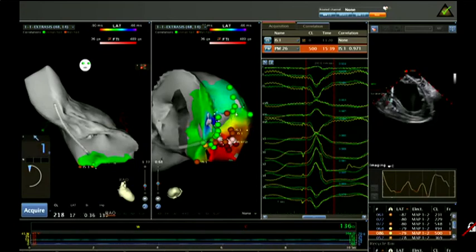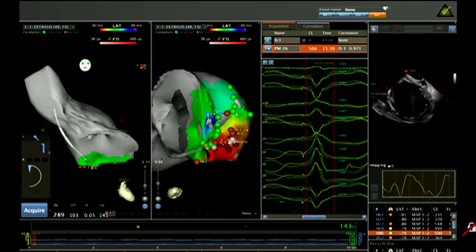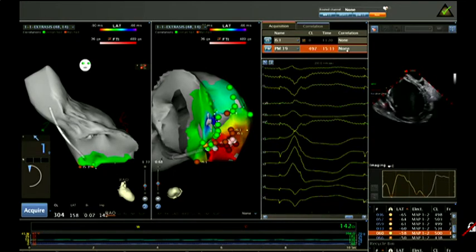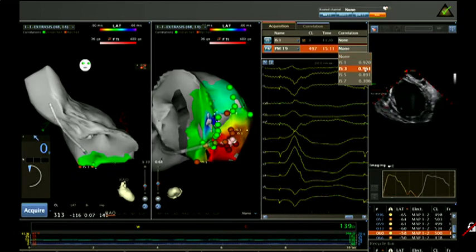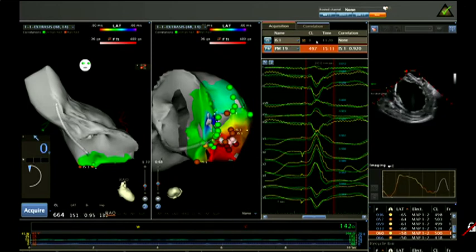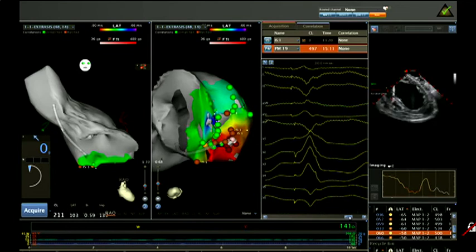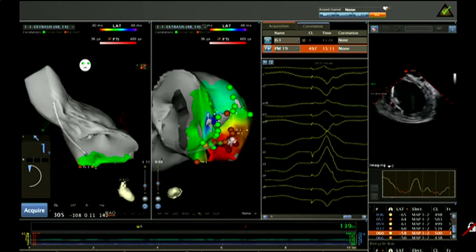And this is what happened. If you see the morphology, you can show a different point. You can see here the morphology. Give me just the green one. It is very easy to mechanically induce this type of morphology.